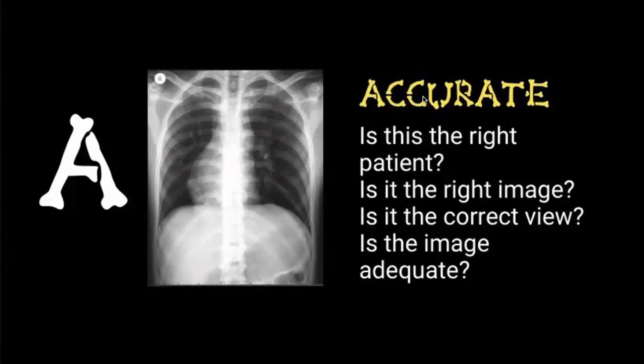For those that are keen in the audience, this is an example of dextrocardia, where the heart is on the wrong side. It's important that you double-check that the image is the right way around, because this is accurate for this particular patient.